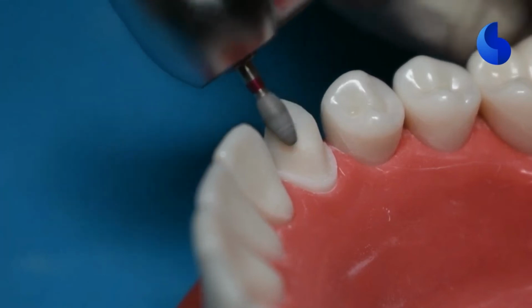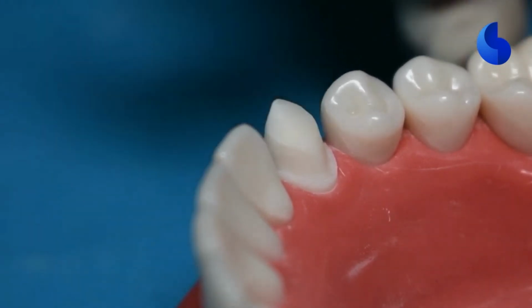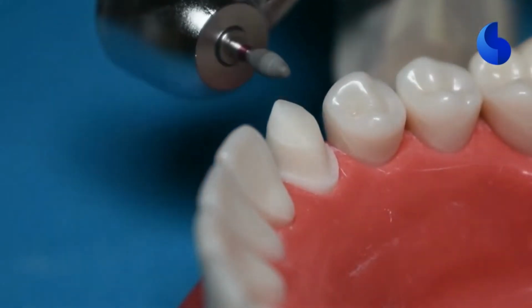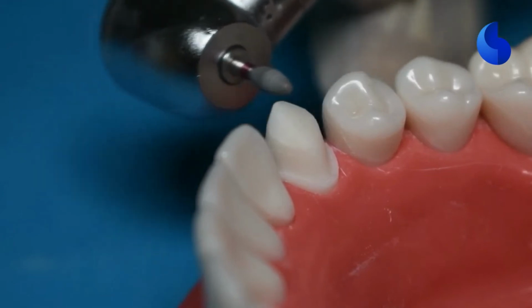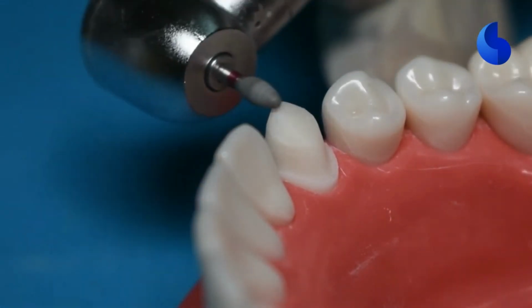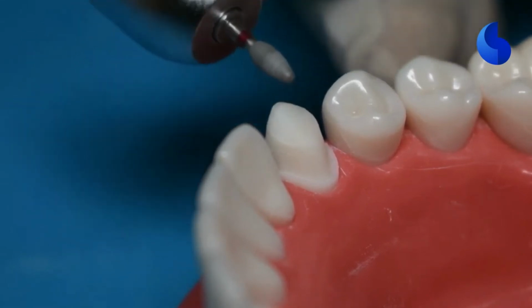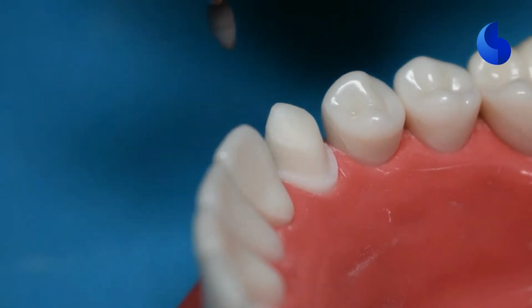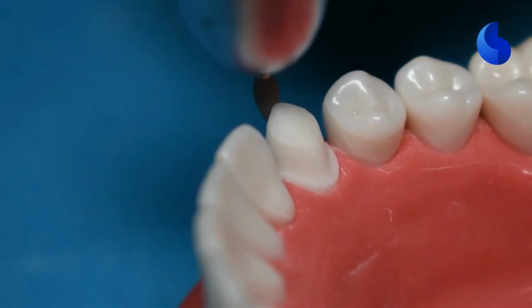Be very gentle and slowly remove tooth structure on either side of this ridge, while also smoothing out and rounding all of those sharp edges that you may have created when you are preparing your tooth. And slowly now round off your incisal edge. Everything should be smooth and round, nothing sharp.